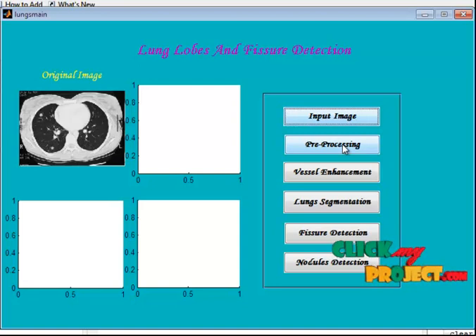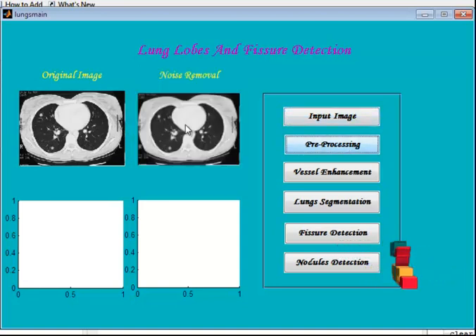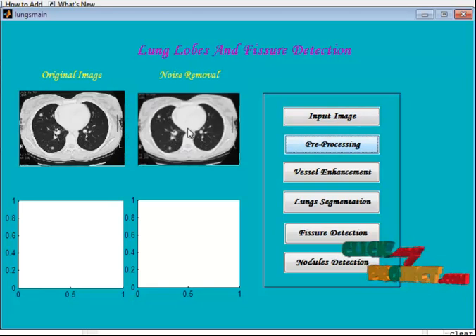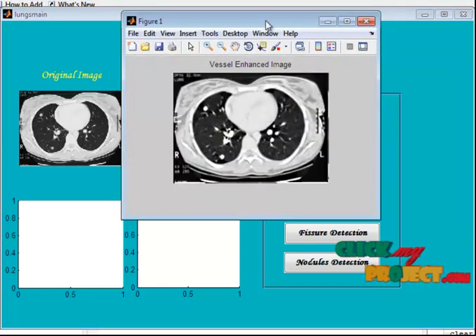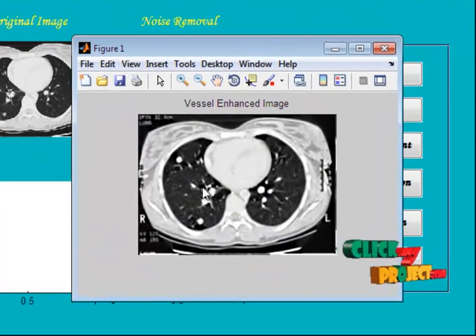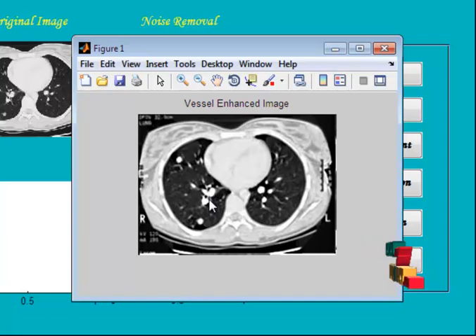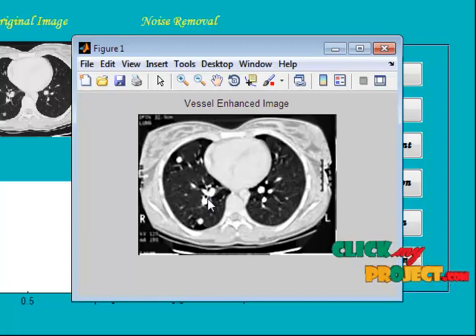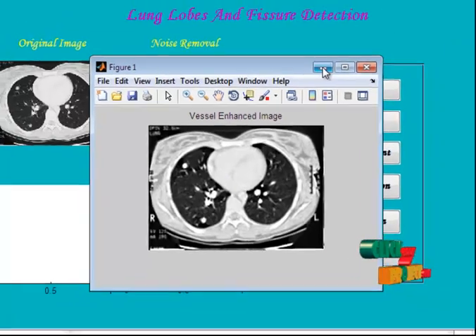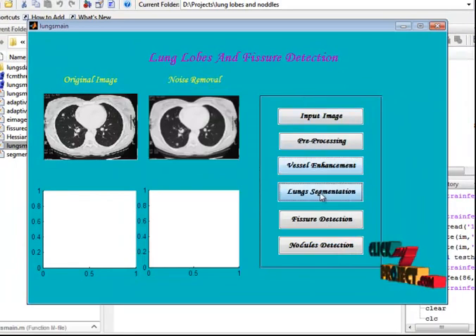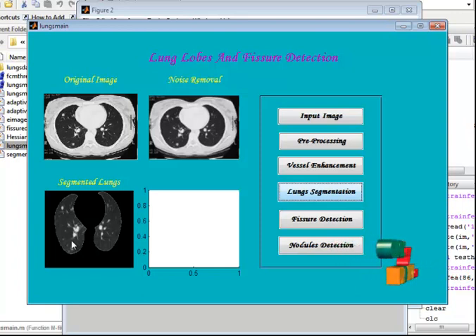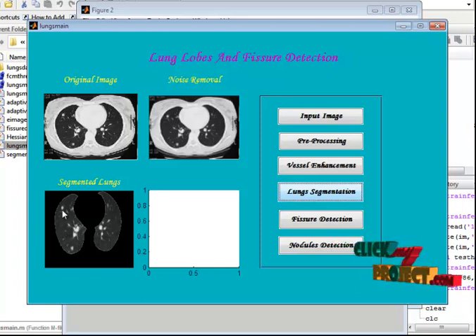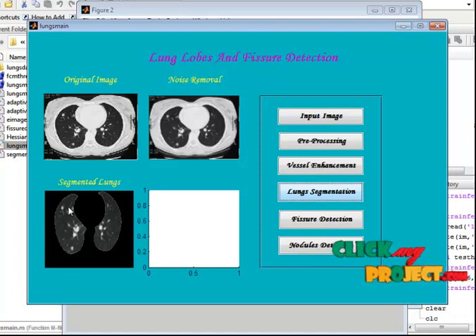This is the noise removal result — the noise-free image. Now we see the vessel enhancement. This is the vessel-enhanced image; the vessels are enhanced using top hat and bottom hat morphological operations. The lung is then segmented from the CT image, and the segmented lung is displayed in the third axis.